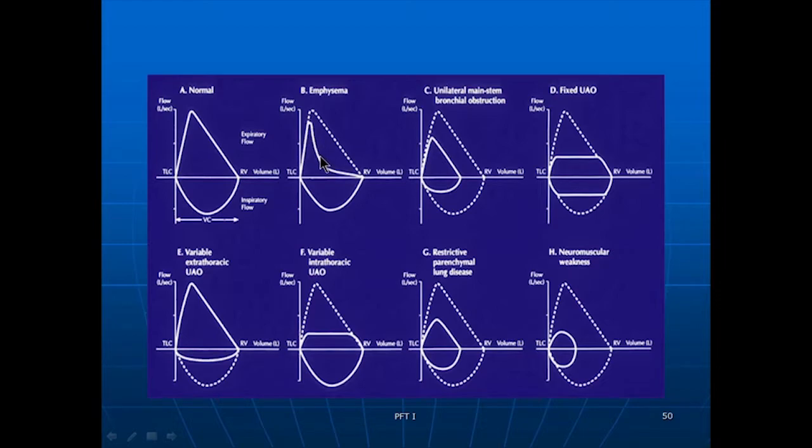So again, the obstructive patient can get the volume out, but they have a problem with flow, so we have this sharp decrease. These patients don't have a problem with flow. You don't see that sharp decrease, that dogleg pattern in any one of these, but they can't get the volume out. So they can't get this volume out, and this is the volume coordinate.